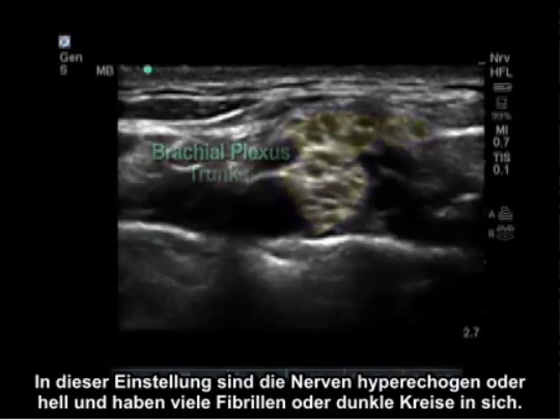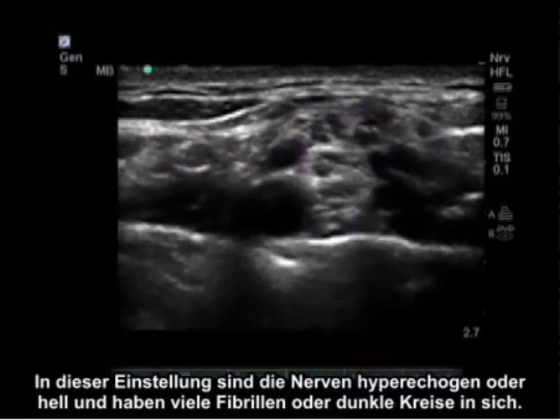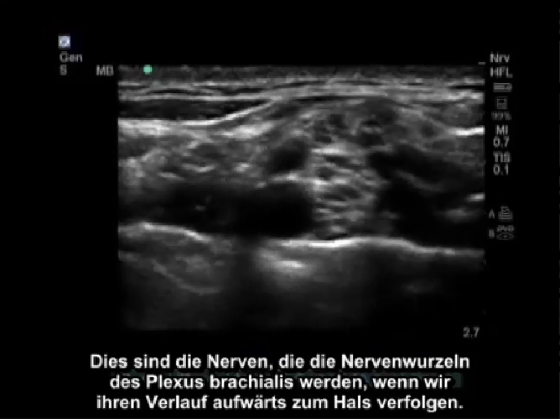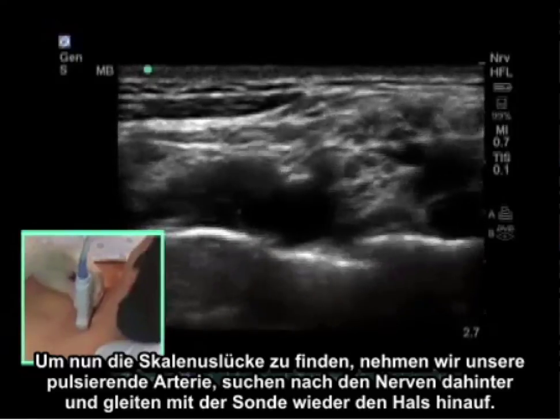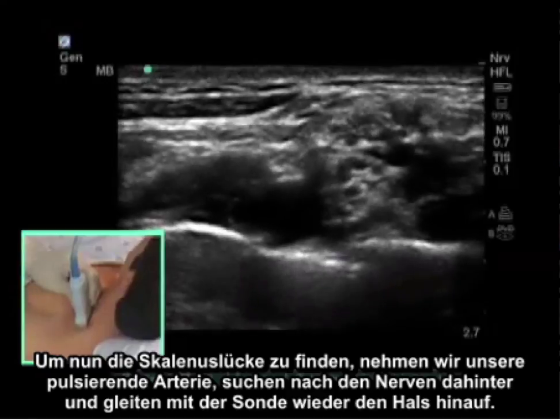Posterior to the pulsating subclavian artery are your nerves. Your nerves in this setting are hyperechoic or bright and have many fascicles, or dark circles, within them. These are the nerves that are going to become the roots of the brachial plexus as we trace backwards up the neck. To find the interscalene groove, we look for the nerves posterior to the pulsating artery and then slide the probe back up the neck.